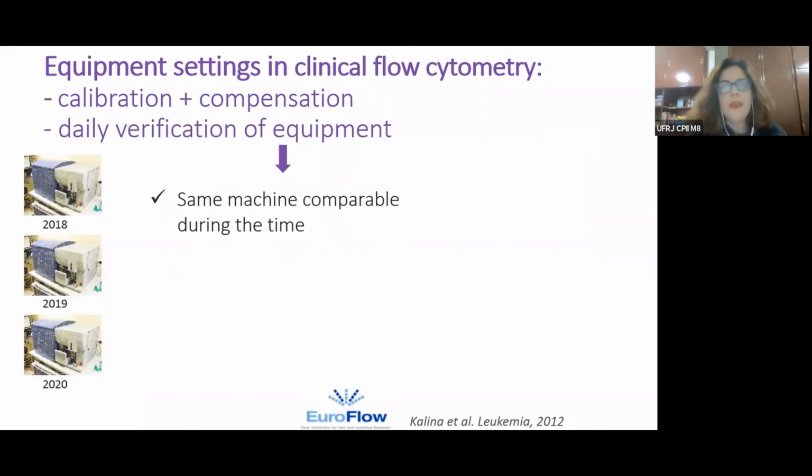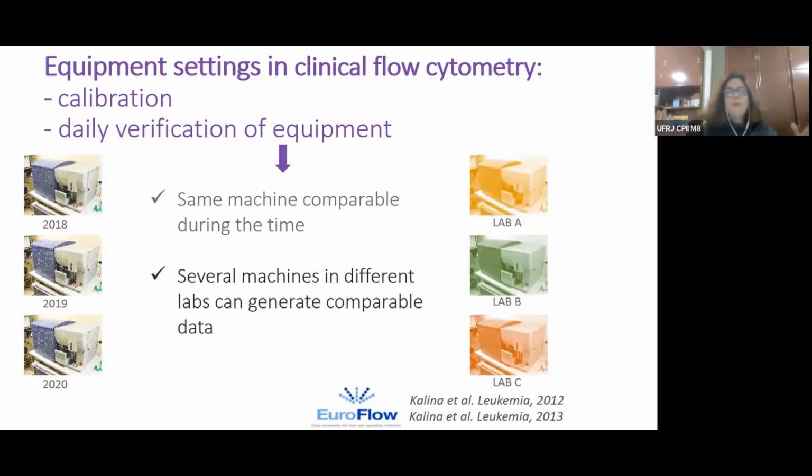So we are able to maintain our machine comparable over time. And also, we now have several machines in different labs completely comparable.